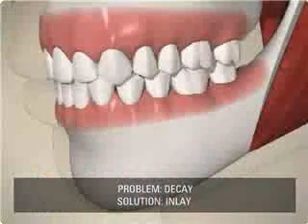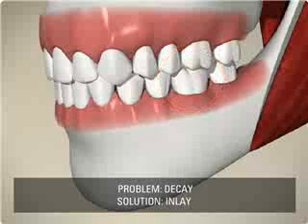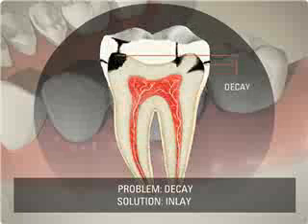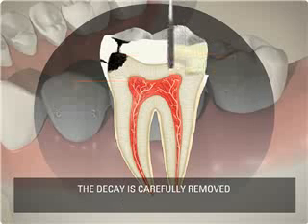For a tooth with slight decay, an inlay restoration can be used. In this example, you can see that the decay is through the tooth's enamel, but not all the way to the pulp chamber. The decay is removed to prepare for the inlay.